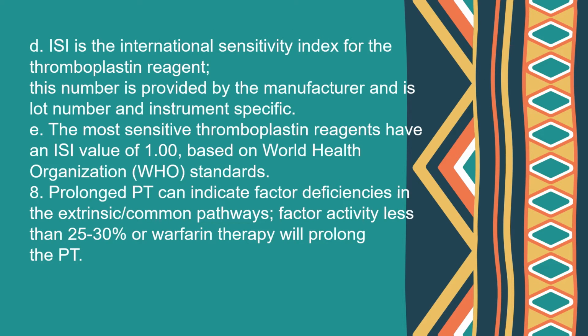What is this ISI? It means International Sensitivity Index for the reagent. This is a number provided by the manufacturer. We can see this in the kit, the testing kit. The most sensitive thromboplastin reagents have a value of about 1.00 based on the WHO standards.